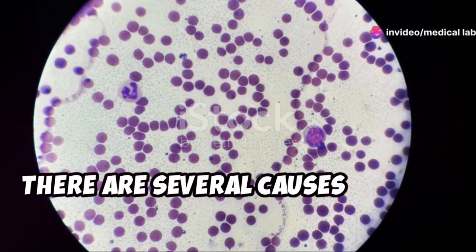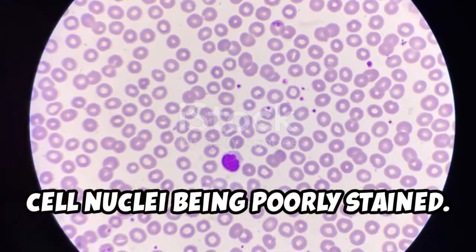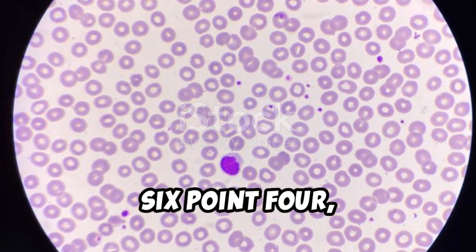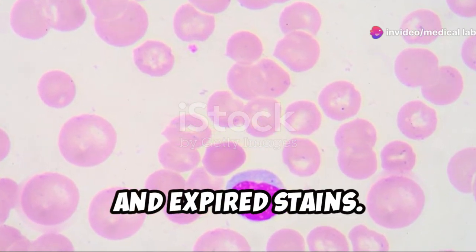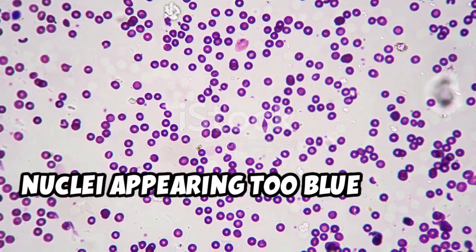There are several causes for red blood cells appearing too red and white blood cell nuclei being poorly stained. These include buffer or stain below pH 6.4, excess buffer, decreased staining time, increased washing time, thin smear, and expired stains.